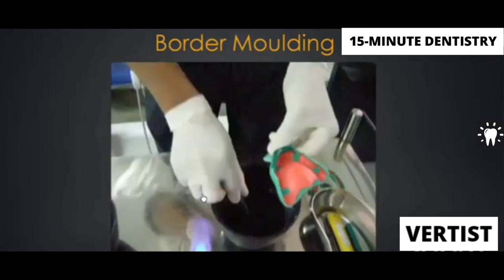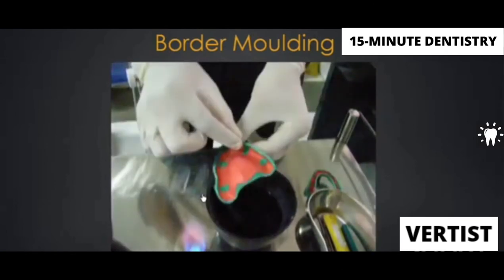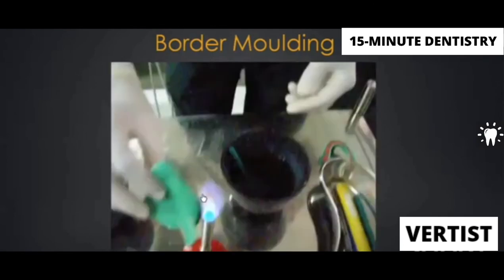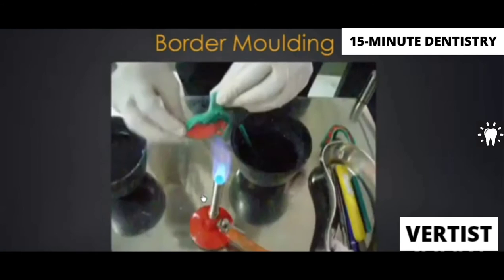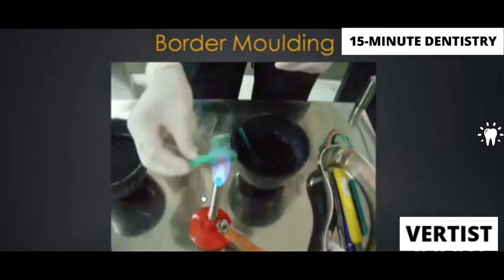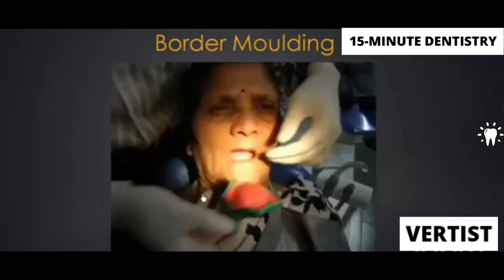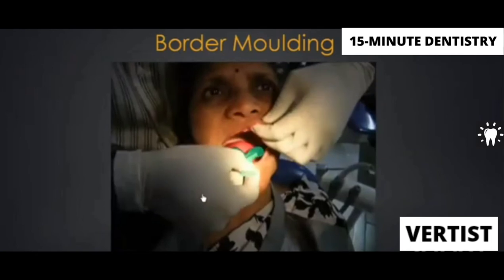This is what you need to do. Okay. Second most important point is, before you place it in the patient's mouth, please temper. Put it in warm water. The temperature of the warm water should be around 110 degrees Fahrenheit or somewhere around 45 degrees Celsius. Don't put dry, heated green stick in the patient's mouth. You are going to burn the patient.